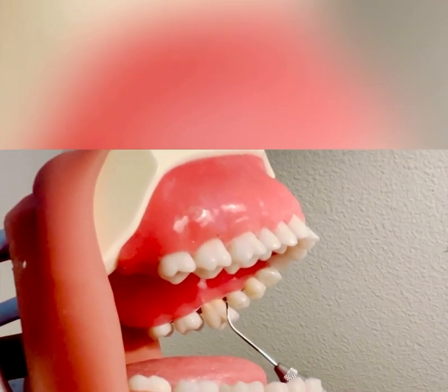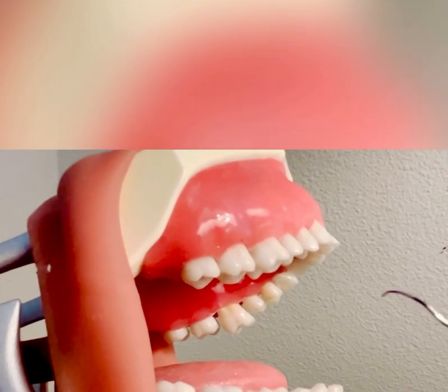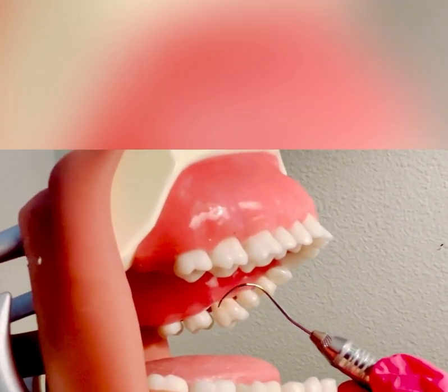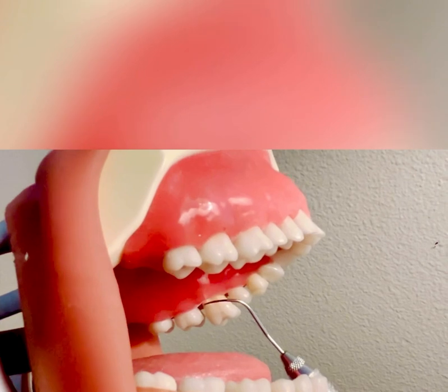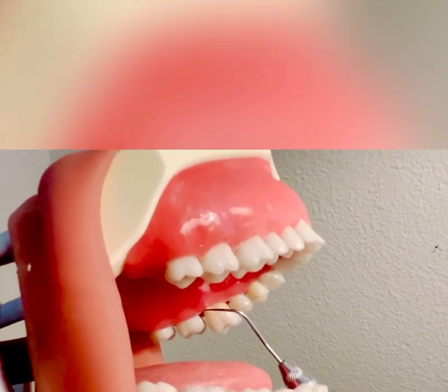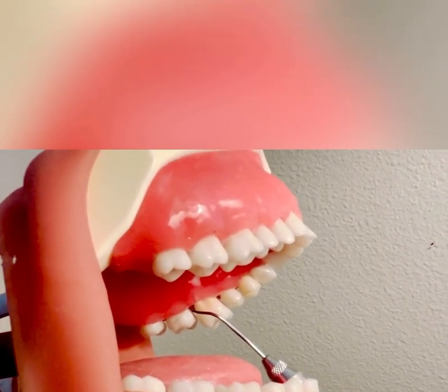Once I assess the mesial furcation on the lingual surface, I'm going to flip to the opposite working end, making sure I have the correct working end. Now I will assess the distal lingual furcation on tooth number 14. I have a modified pen grasp and I'm going to insert right at the distal lingual line angle.